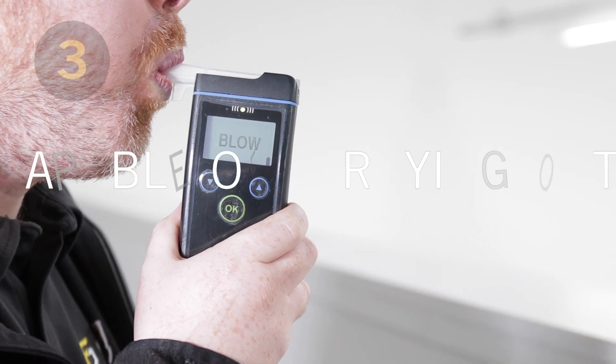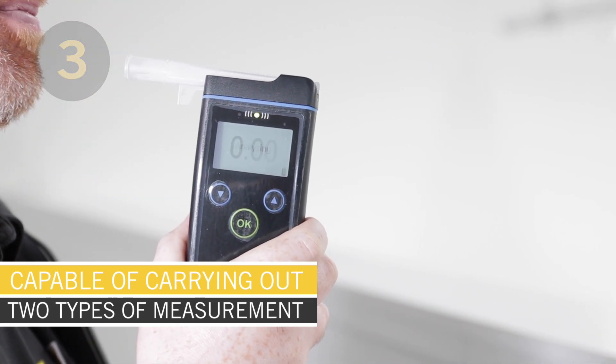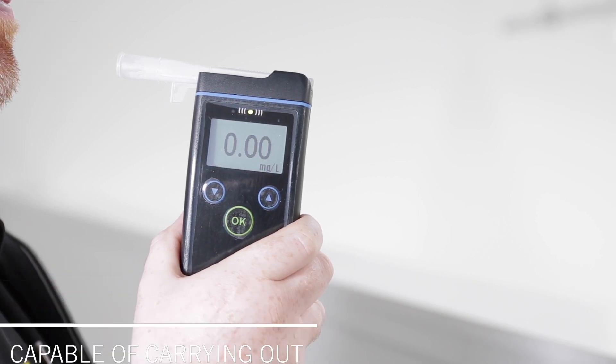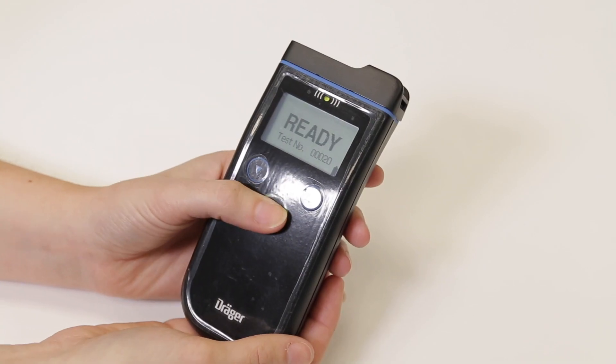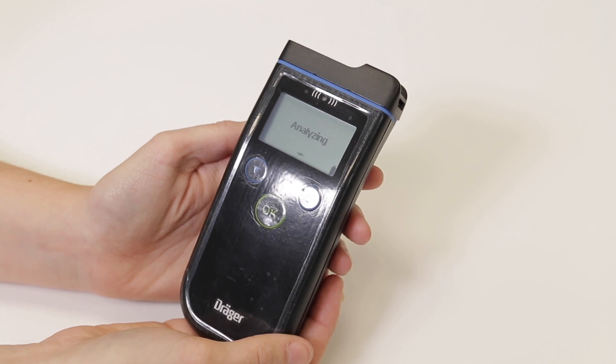It's capable of carrying out two different measurements. It can carry out a measurement of a person's breath using the mouthpiece, or it can carry out a passive sample of the ambient air or breath of an uncooperative or unconscious person.